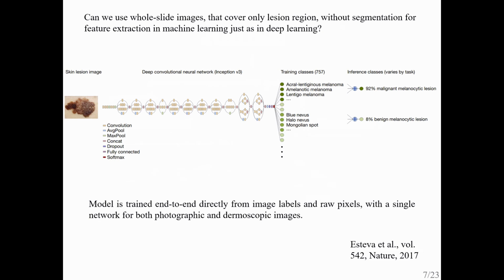There's another study that is convolutional neural network-based image classification. They used whole slide images. Depending on some filtering approaches, they created different combinations of lesion patterns, and then they created features. When we look at the MedNode dataset, we can use whole slide images without any segmentation, and we can use some textural patterns and oriented patterns to create meaningful features for the training process.